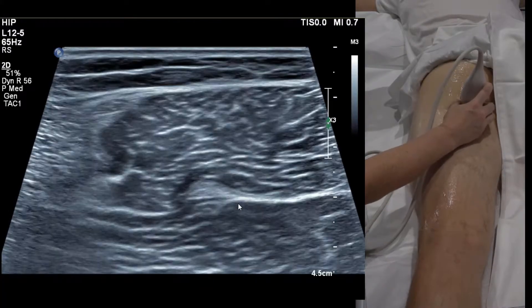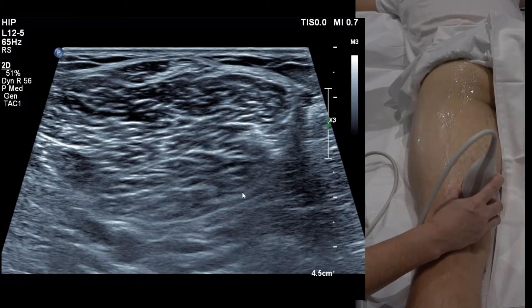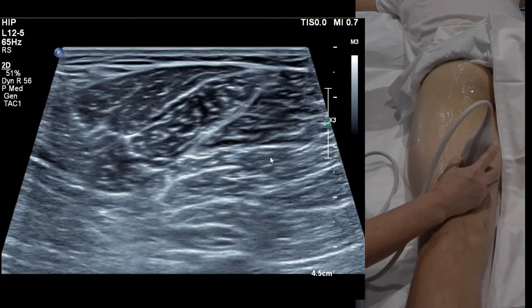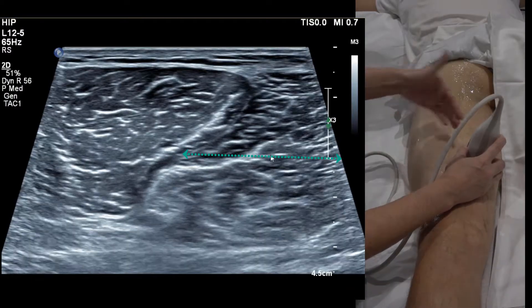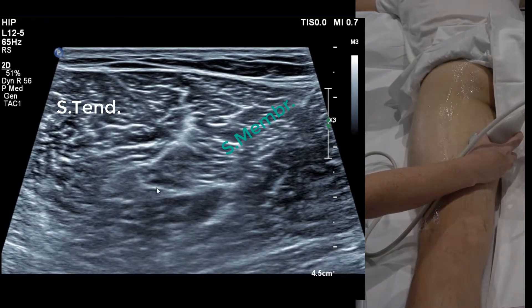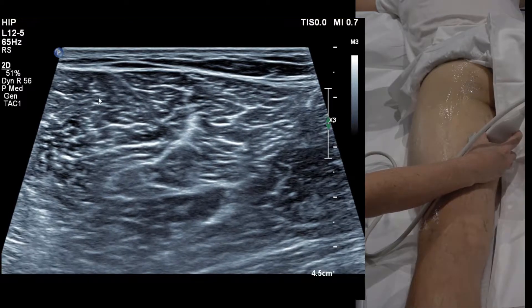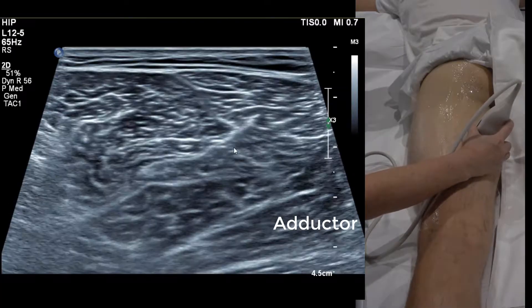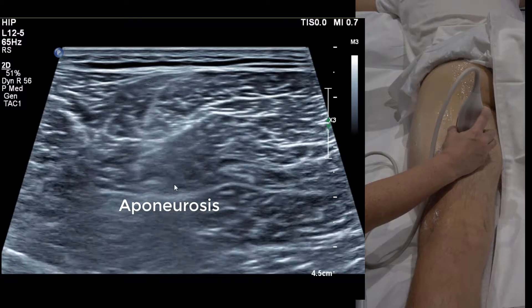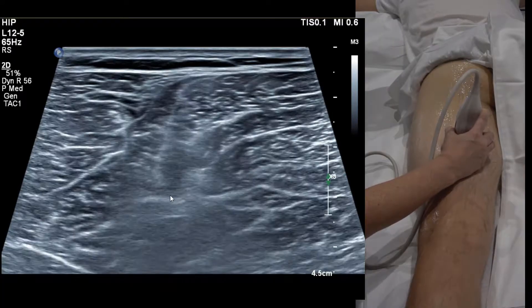Now follow the semimembranosis proximally — it does the reverse of semitendinosus: it's big at the bottom and skinny at the top. Towards the groin, it turns into a comma shape, flanking the semitendinosus. Anterior to the semitendinosus, there's a white fascia which is an aponeurosis — and that's actually part of semimembranosis as well.